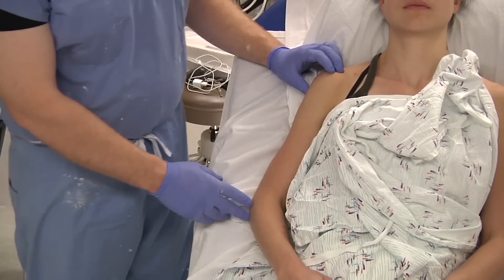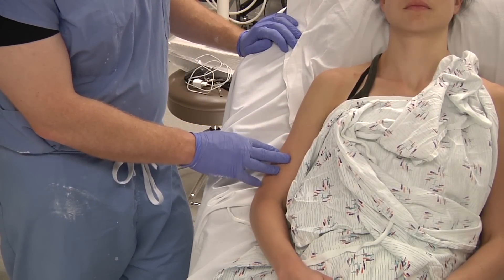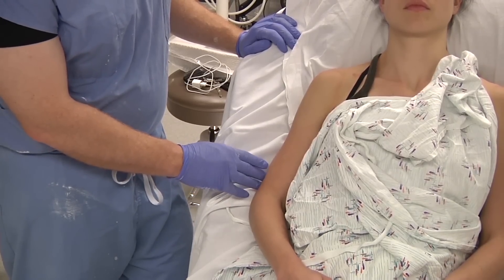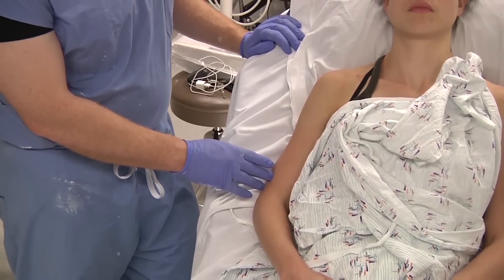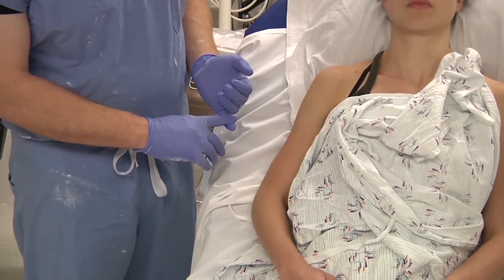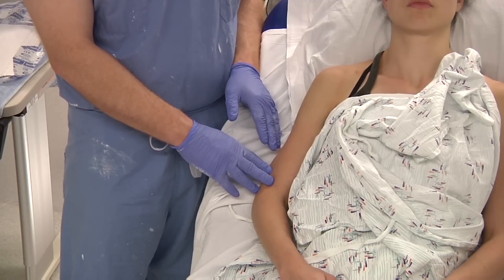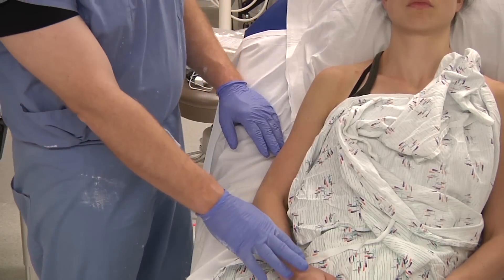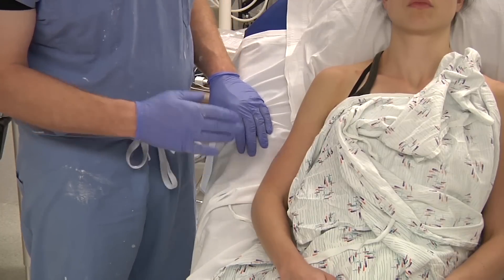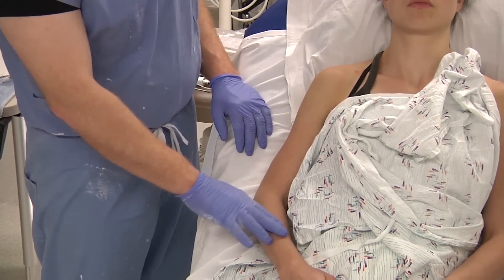We're going to be applying a coaptation splint. This is commonly used in mid-shaft humerus fractures that are displaced or angulated. It's very important to make sure you have an appropriate neurovascular exam, especially in the setting of a Holstein-Lewis fracture or a distal spiral fracture of the humerus. Making sure that the radial nerve is intact is especially important, as that is well documented to be a potential complication of that fracture. Also check vascular status.